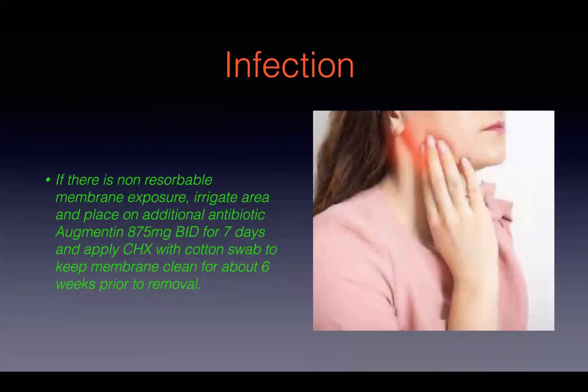So what I did here, after I did the flap with releasing incision, I mixed some cortical cancellous and also an autograft from her, from the anterior nasal spine. In that area, that's my go-to, and I mix the two together and place some collagen membranes and membrane tacks. I used my bone scraper to scrape the anterior nasal spine.